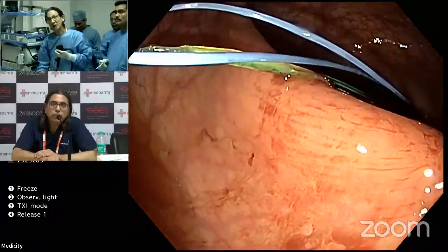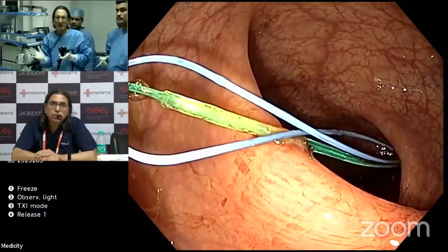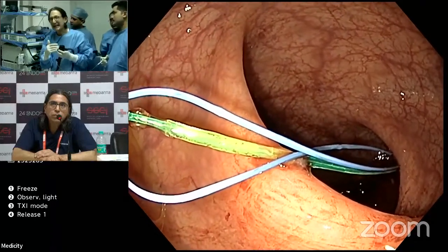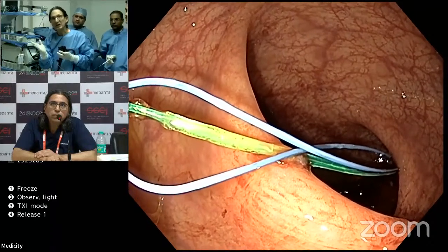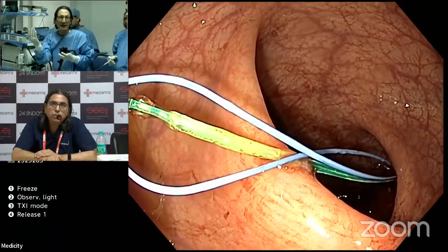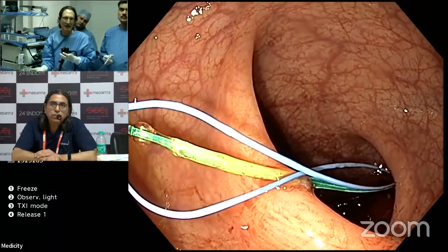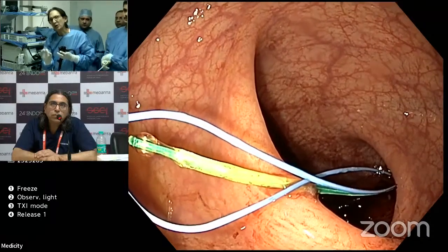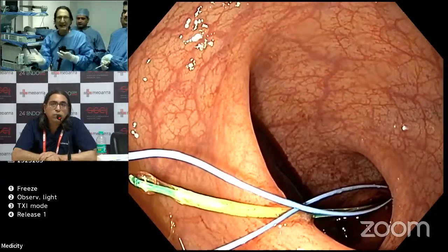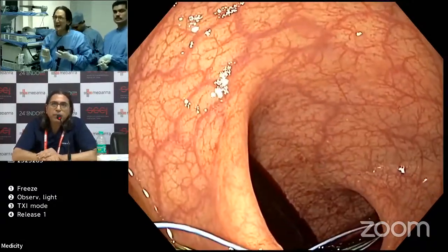Yes, so the reason why, in the rectum, it's all the question of anatomy. So in the rectum, especially if you're below the peritoneal reflection, then I think to do full thickness resection is very safe. And I do that commonly where I've already looked at the perirectal fat and it really has no consequence because you're not in the peritoneum. In the stomach, you're very safe because you have a very thick wall. But in the sigmoid and the colon, it's very different. And the wall is very thin.